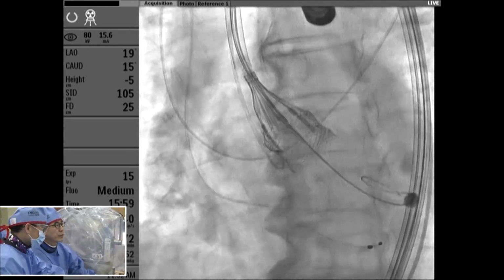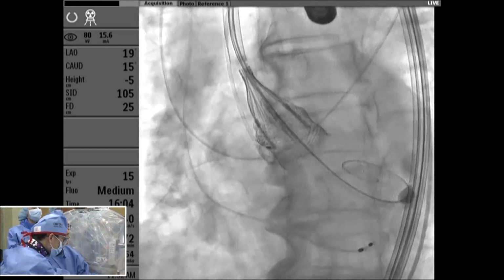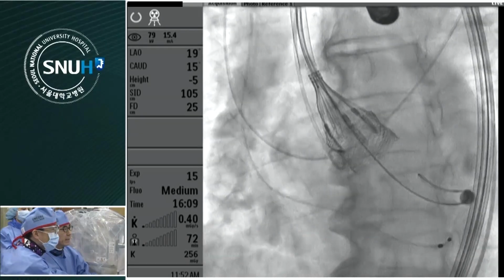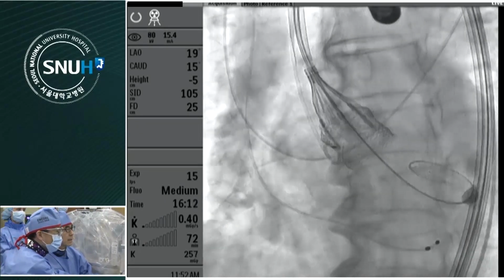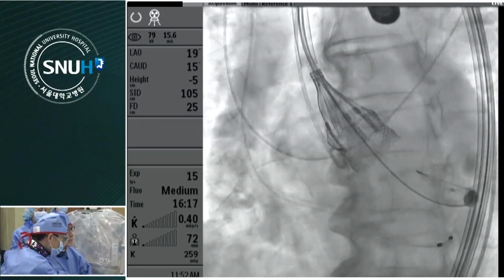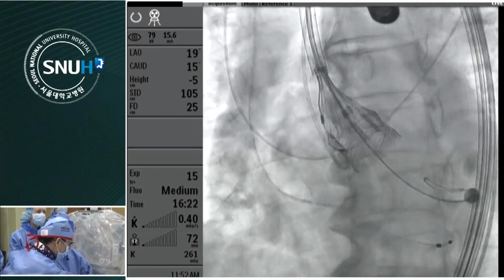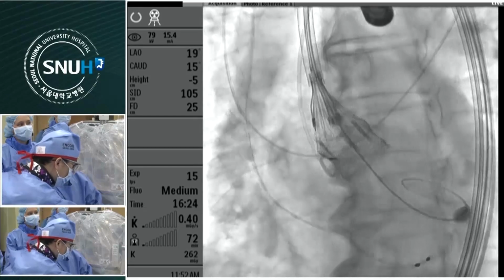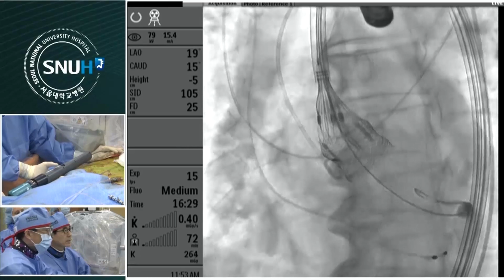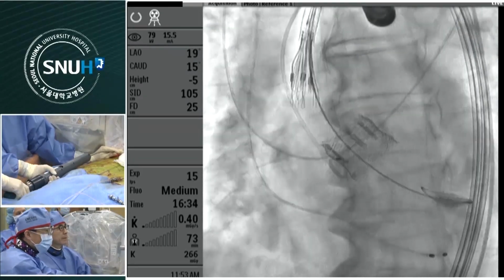Okay, we are going to release. Release phase one. Agree. Can you notice the movement of the central pin? Everybody is watching it. Can you show us the hand? Release second phase, please. Please check the mandrel. Okay, good.